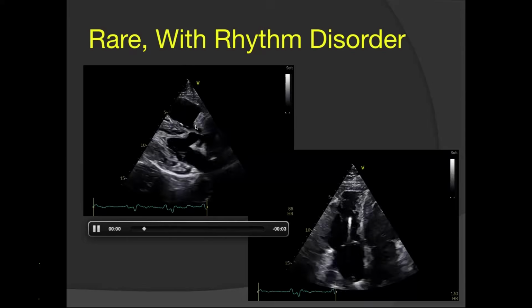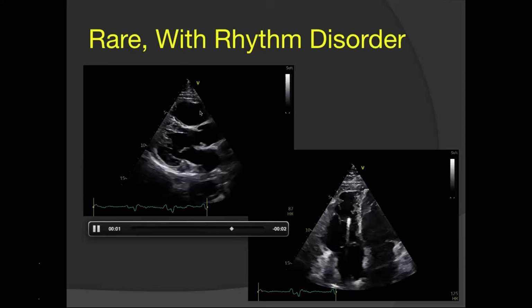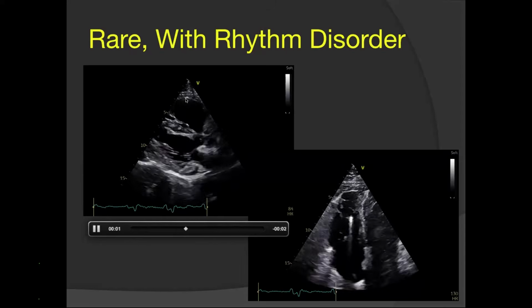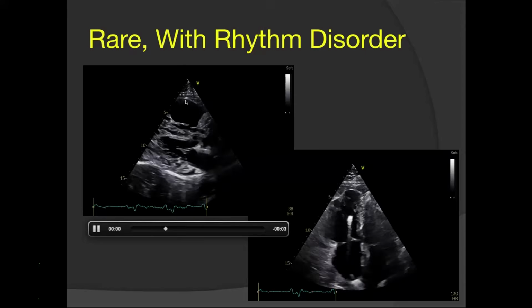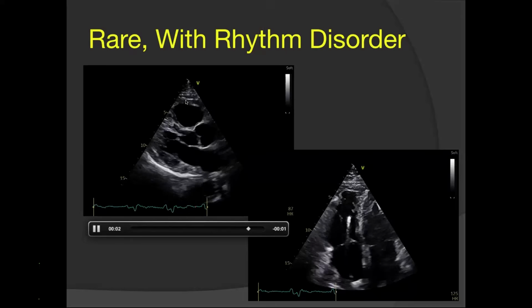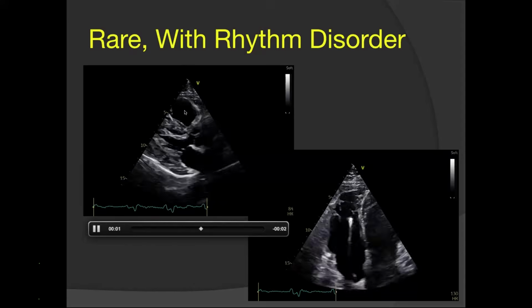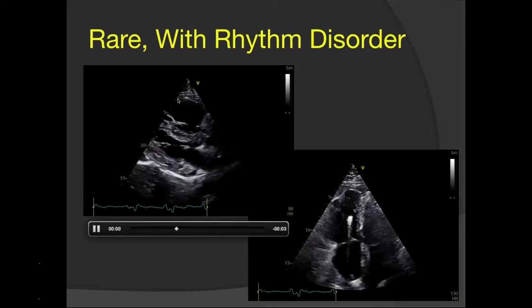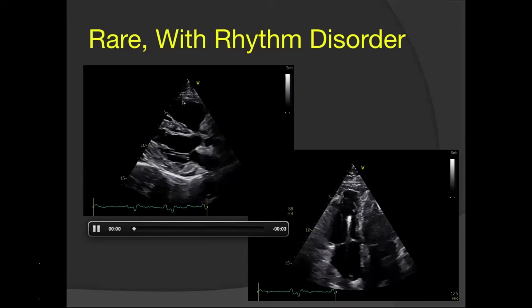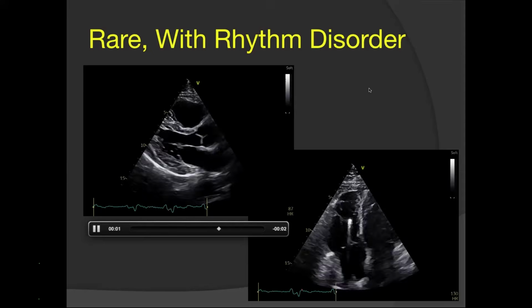And clearly, in the first view itself, if you look at the parasternal long axis view, you can see that the RVOT in this case is very thin and almost bulging outwards. So this is the area which is commonly involved in the triangle of dysplasia, which is reported in ARVD, and one of the areas where you commonly find thinning and replacement with fibrofatty tissue in ARVD is this part, RVOT, along with the other areas included in the triangle of dysplasia.